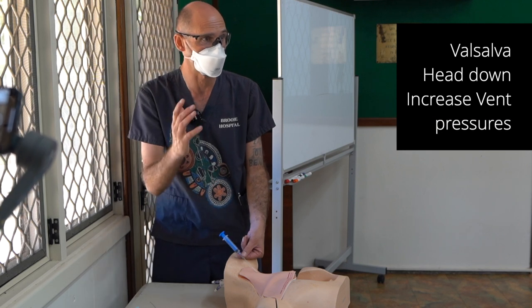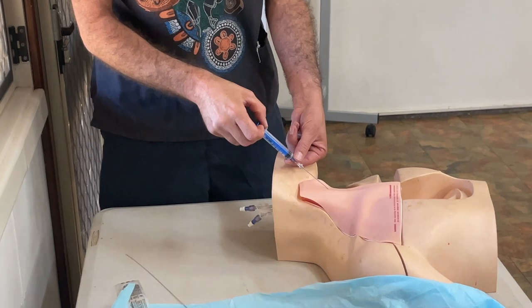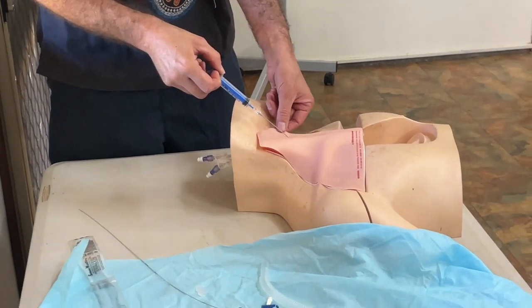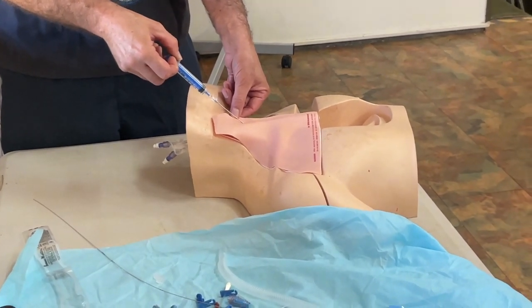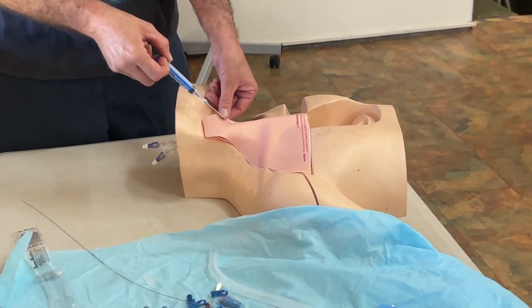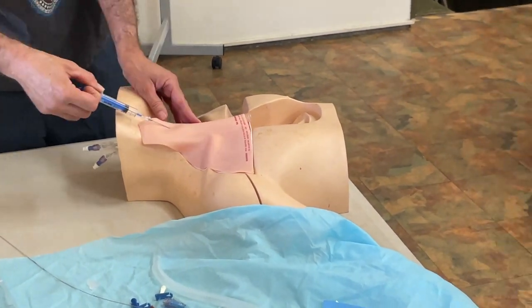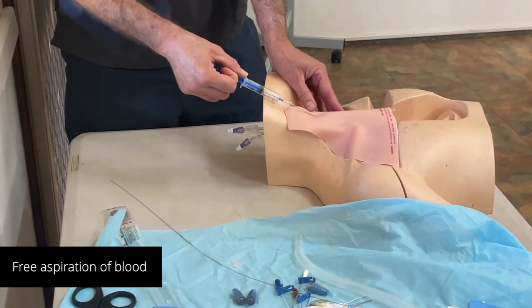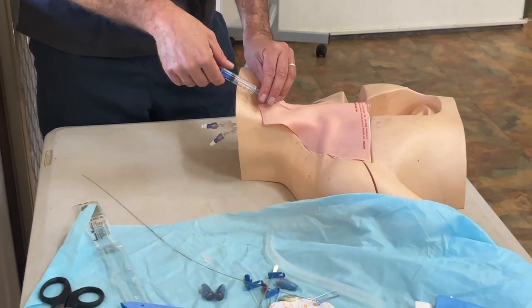You can Valsalva, or do it when the ventilator's pushing air in — get them to Valsalva. So I get in a good position, pulling back on the syringe. I tend to bounce the needle down gently on the surface of the vein — bounce, bounce — then Valsalva: pop. Now I'm pulling back and there's blood coming back. Blood coming back — awesome. So I stop there.